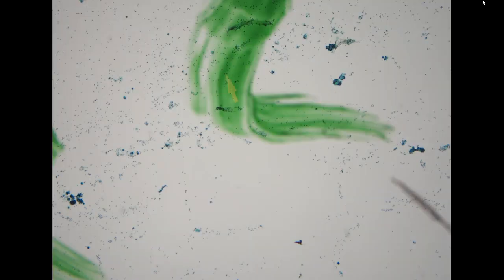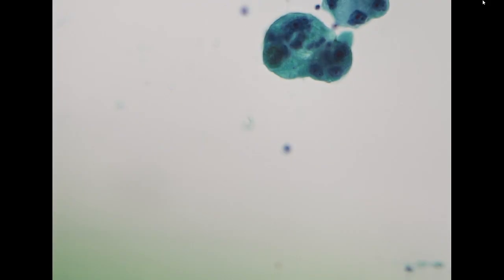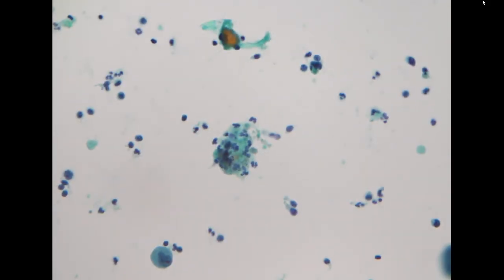The next specimen is also a pleural effusion. The patient has a lung cancer history. This is very common in our practice. We see probably 5 cases every day. So this is high-grade adenocarcinoma. The cells are markedly enlarged with abundant cytoplasm, quite foamy and vacuolated, and with three-dimensional clusters. So this is positive for adenocarcinoma.